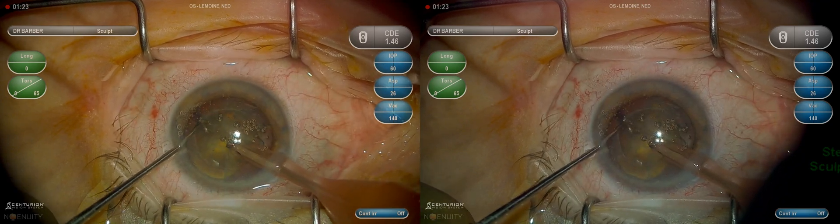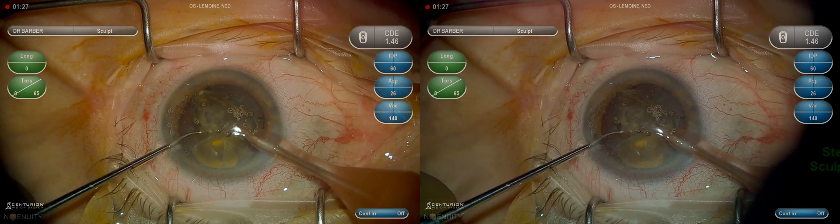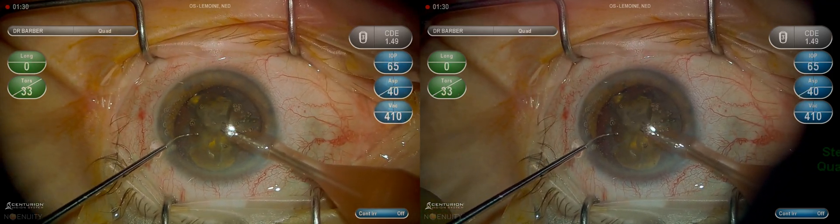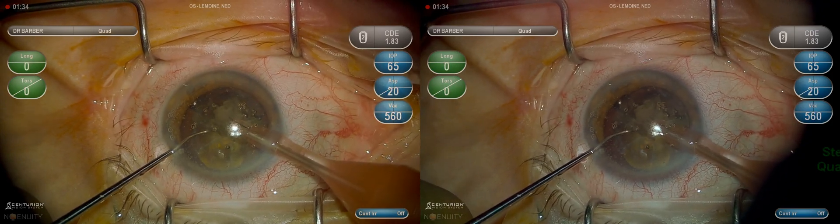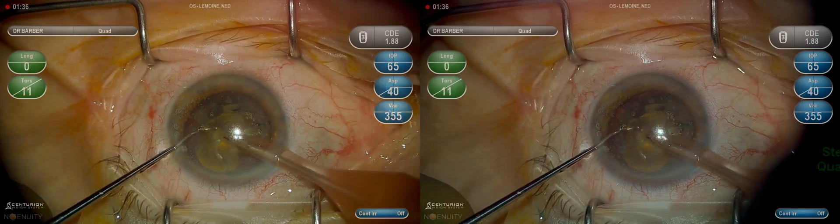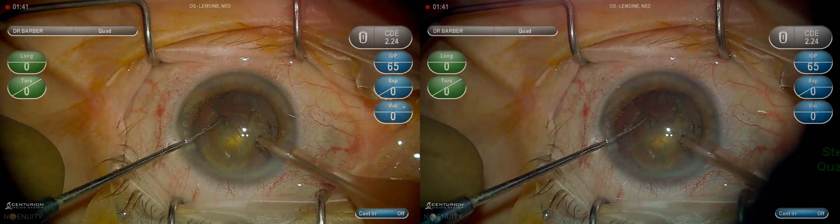Going posterior to the lens material with the second instrument and bringing the nucleus into the central safety zone. Being mindful to keep the phaco needle in the central safety zone. I prefer to phaco at the iris plane, not deep in the capsule or bag.